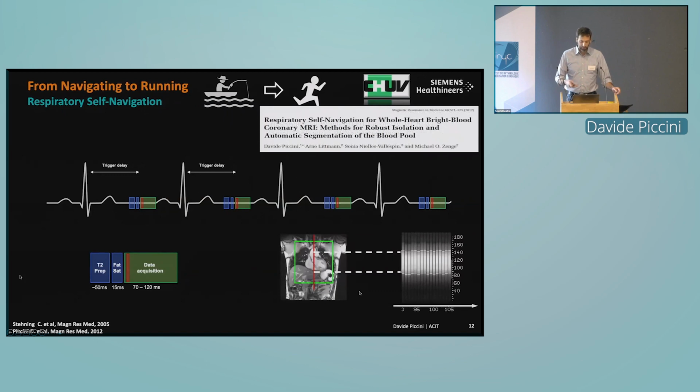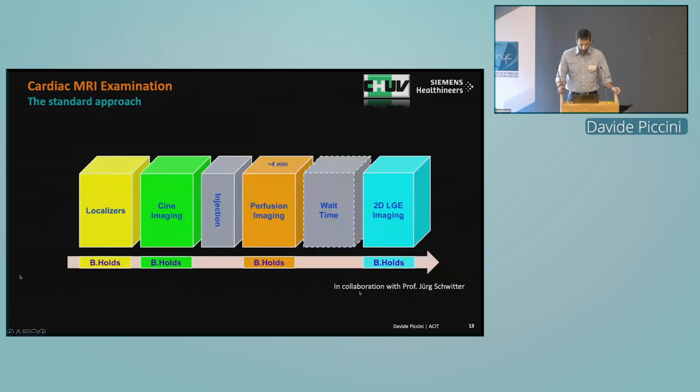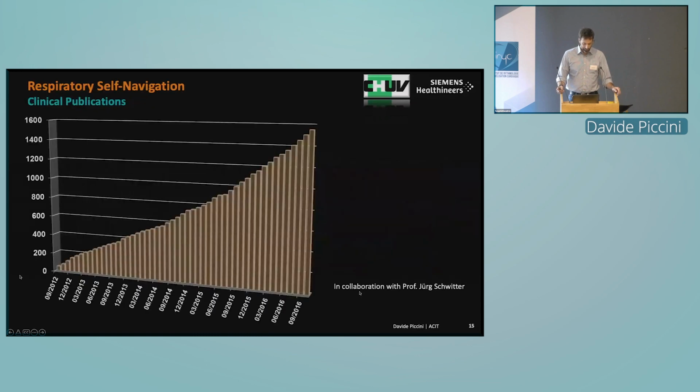And then we use a slightly different version of it that was developed in Erlangen. And what happened in Lausanne at the beginning was that, okay, this worked at the scanner, which was obviously something very appealing for the clinicians. So both acquisition and reconstruction were fully implemented at the scanner. And so we tried to insert it in the clinical protocol in a place where they would not do anything otherwise. And this was very successful over time.